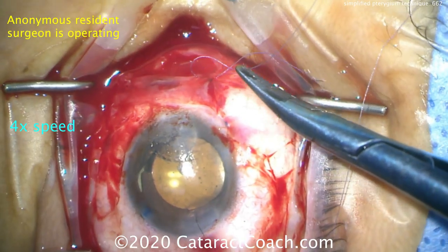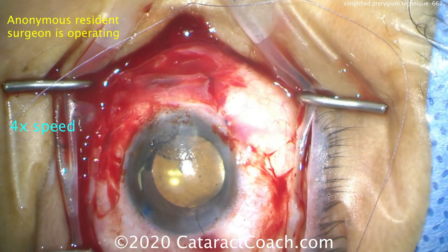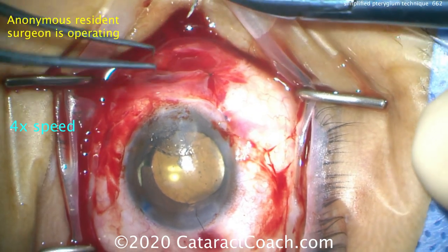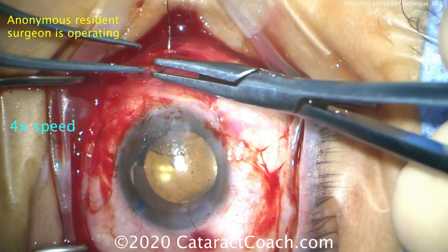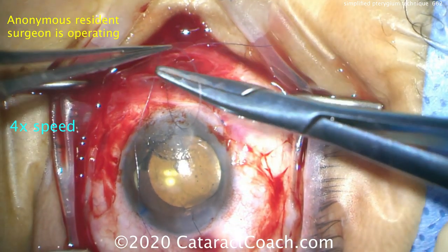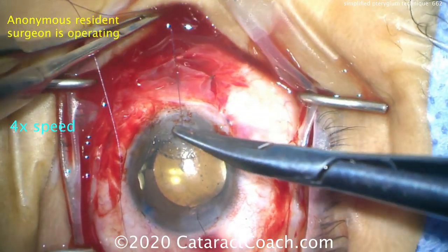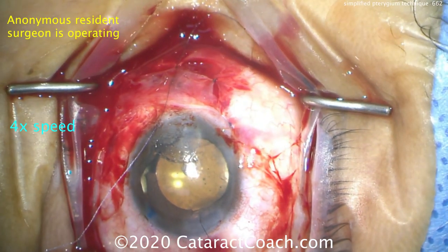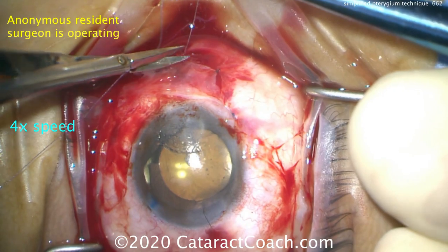This will close up the conjunctiva over the original site of the pterygium. A few more sutures will be placed — you don't want to leave any big gaps. We've put the video at four times speed. Certainly you should be proficient at suturing even as a beginning surgeon; that's something you can practice in the wet lab and get very good at. Tying this up, cutting those off — looks pretty good.